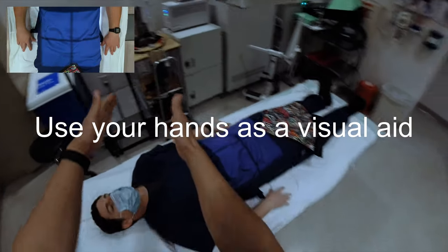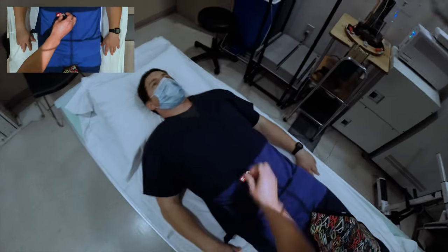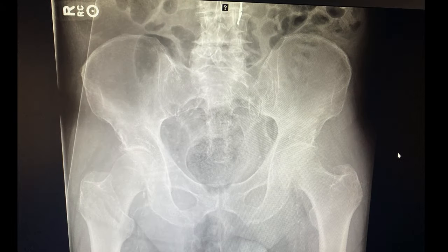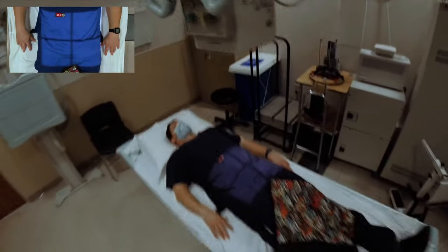So you're going to roll your toes together so they touch. There you go. And hold still. All right, you can relax your toes.